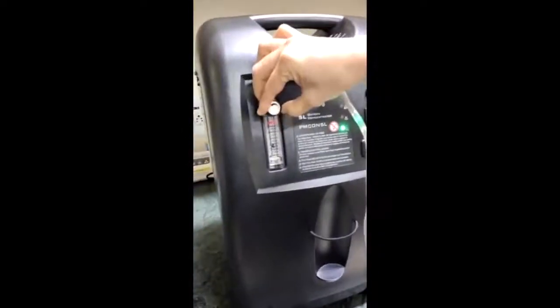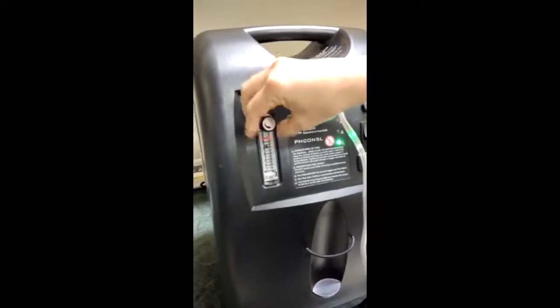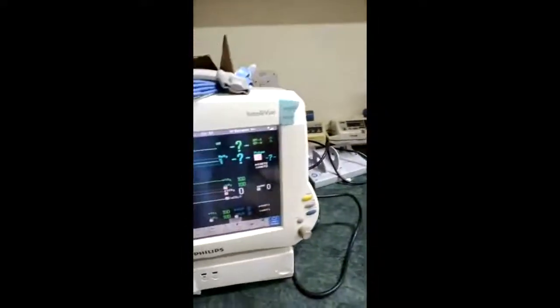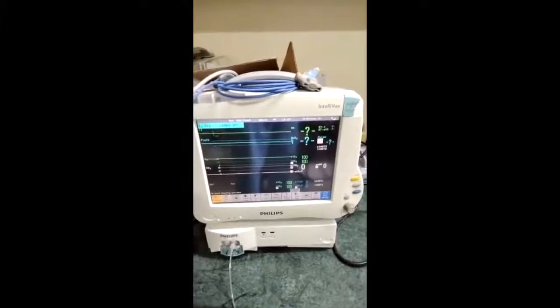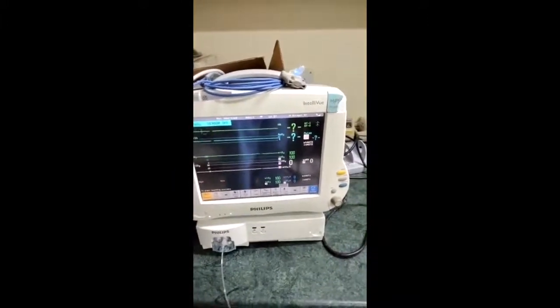Now increasing the flow to the maximum of 5 liters per minute — remember, this concentrator delivers a maximum of 5 liters per minute of oxygen. You can see the oxygen concentration is still 100%. So we confirm that this concentrator delivers 100% FiO2 even at maximum flows of 5 liters per minute.